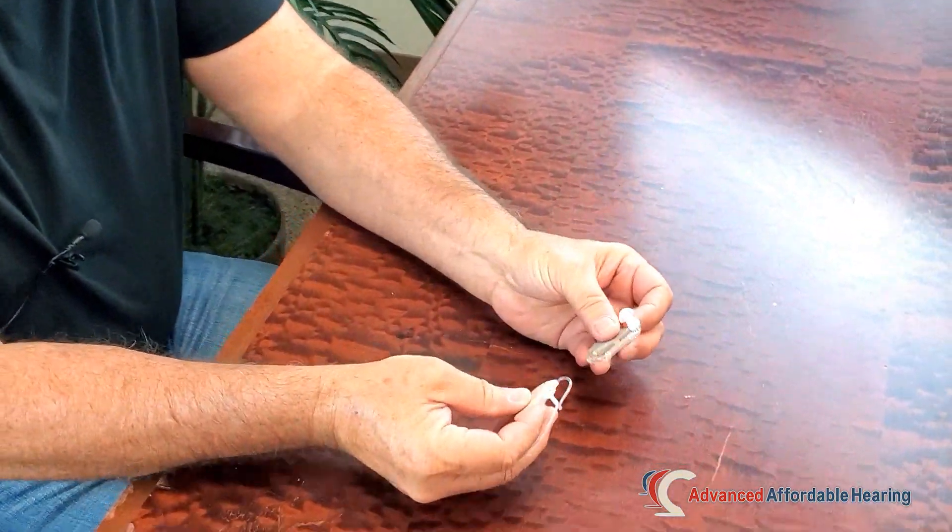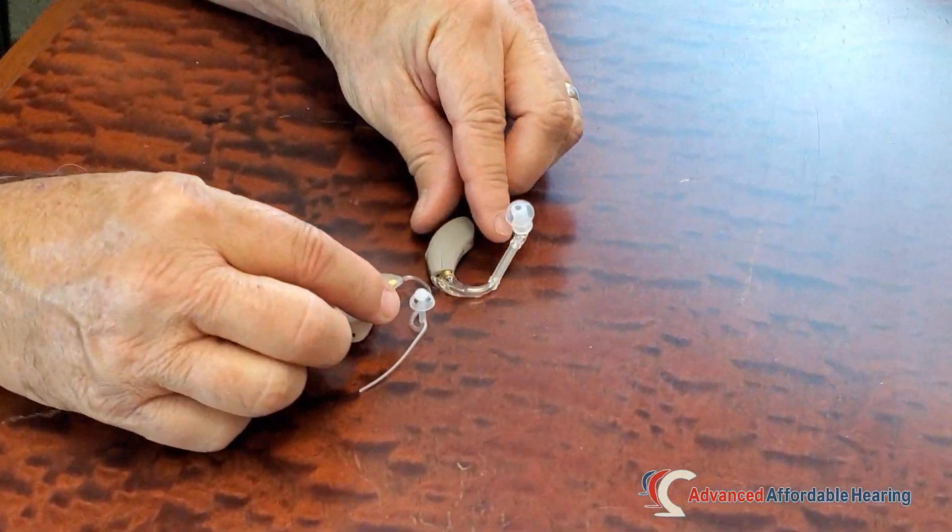A lot of times with a hearing aid, you just need a little bit more power, or you need to magnify tones that are in a deeper pitch. There are two different tubes that we have available on any given hearing aid.